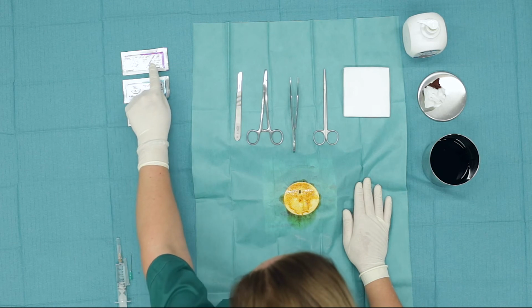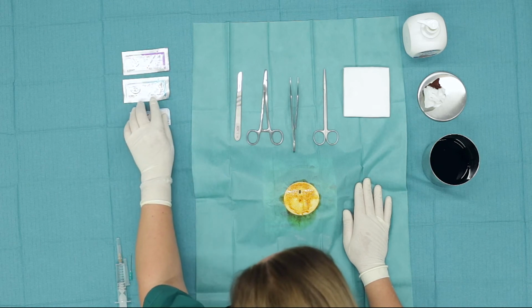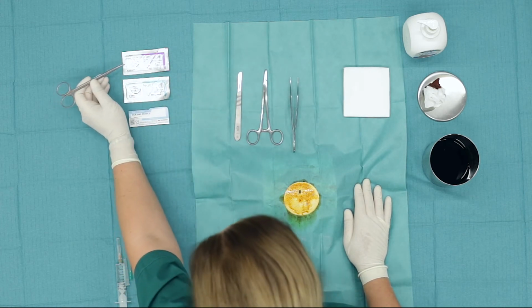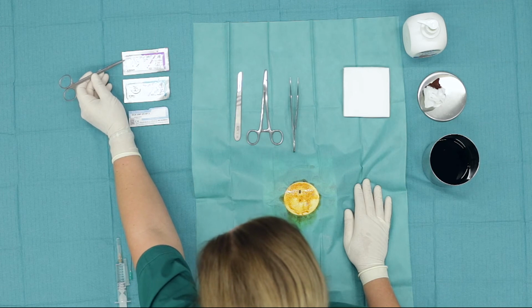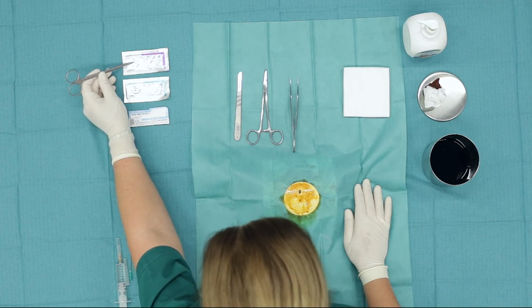The sutures are divided into absorbable sutures and non-absorbable sutures, as indicated on their packaging. These sutures are absorbable and have a triangular needle. This is the other feature of the suture, as well as the curvature of the needle.